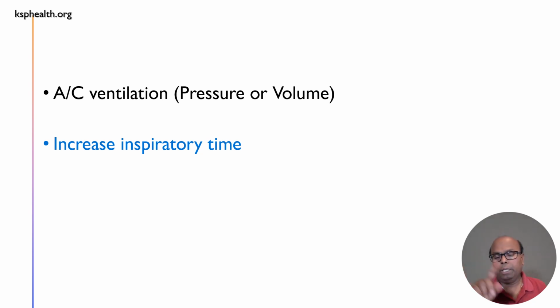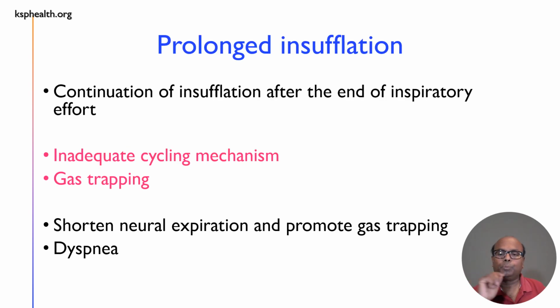And again, you see in AC volume mode, what do you do? Increase the inspiratory time, because the patient needs more inspiration than what you set. Next, prolonged insufflation. That means continuous insufflation after the end of the inspiratory effort.